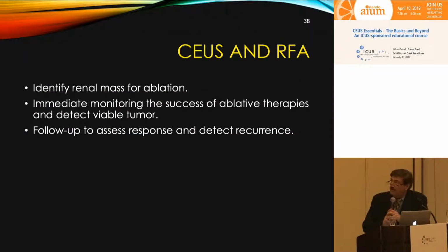We do our RFAs with ultrasound contrast. It allows us to identify the renal mass. I think we can see the borders better. And again, as I mentioned this morning, immediate monitoring of the success of the ablation.